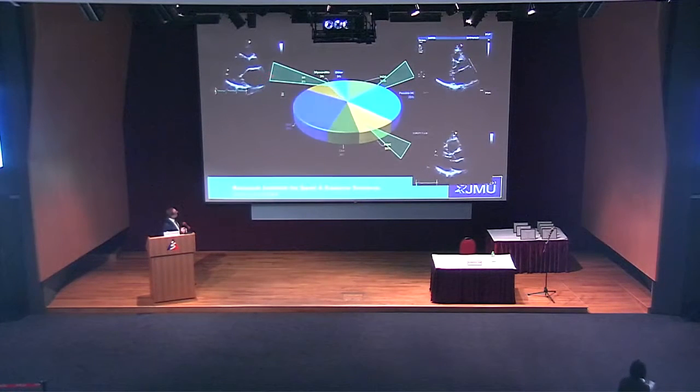Likewise, this is one of a dilated cardiomyopathy, big left ventricle, much bigger than some of the athletes we see, but the fact is that the ejection fraction is around about 20%, so very, very poor function. And this is an arrhythmogenic right ventricular cardiomyopathy, and you see the big right ventricle, much bigger than what we would define in physiology. We've got aneurysms and dyskinesis up here. So these are barn-doors, and this makes our life easy as an echocardiographer.